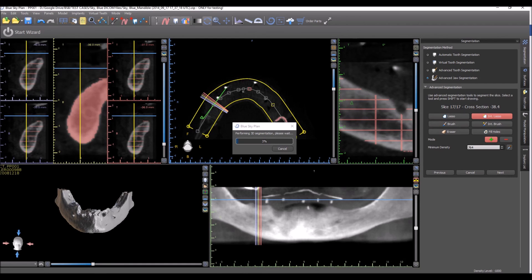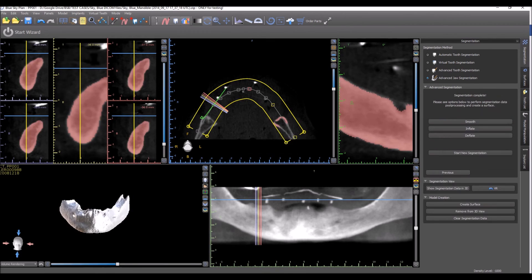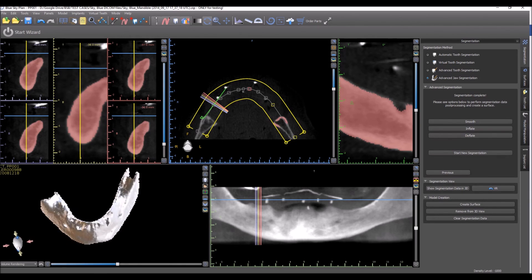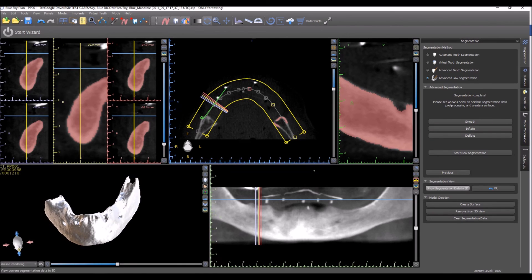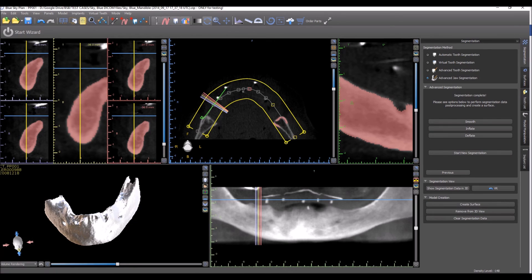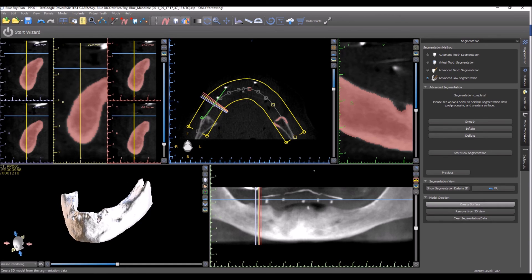The software is now creating the new surface based on the definitions that we just completed. We can see in the bottom left in the 3D view what's being created. We have the option to create a surface, which will create a new STL surface in the software, the option to remove it from the 3D view if we wanted to cut it out of the CT scan, and clear segmentation data if we wanted to do the process again.